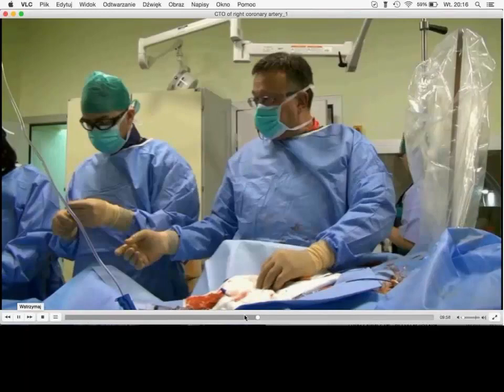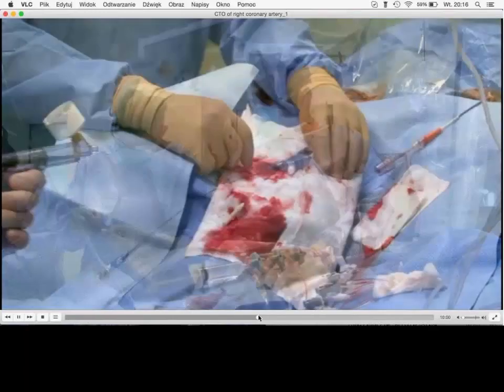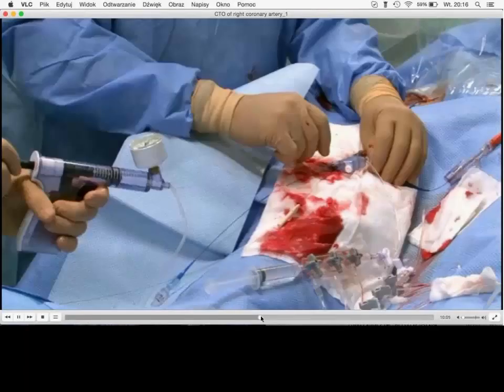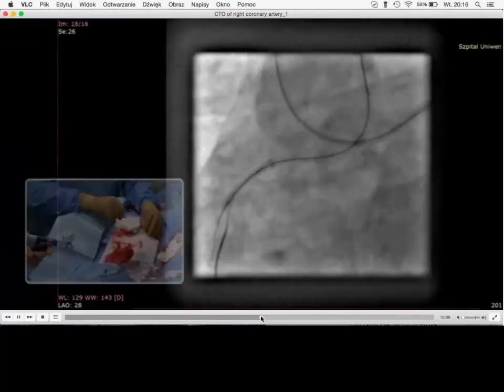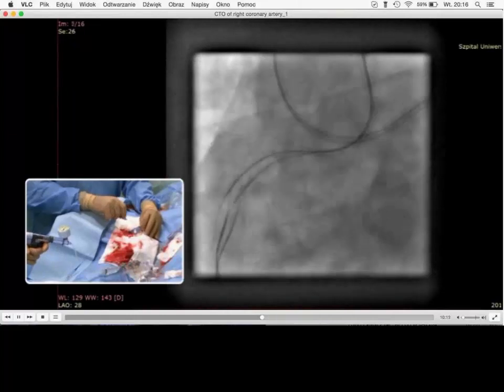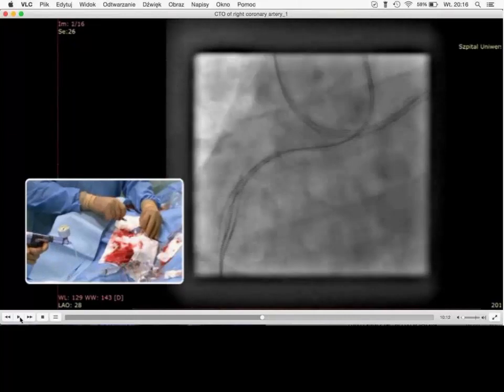You use sometimes those techniques? To be honest, we try to trap instead. We like the trapping more. Yeah. But in cases where you cannot trap, we use this technique as well. I think it's a little less reliable than the trapping, but definitely very good to do in some cases like this. Yes, but for the trapping, you should use the balloon. The balloon costs some money, and the water costs nothing. Correct. So, no, I agree with you. But the downside is, sometimes we've done it and we lost the wire.